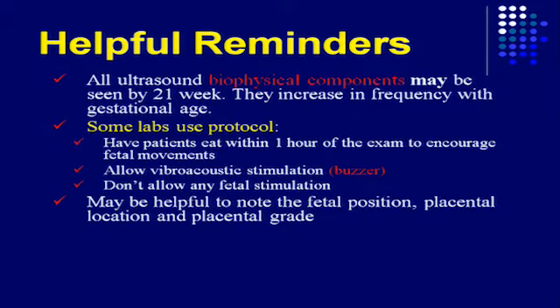But sometimes, we've had a couple that have had in utero strokes. So the things that you get the breathing, they're still doing the breathing, but they're not doing the movement and tone. So make sure that you do look at each component individually. And it was one of our nurses who picked that up because this baby just is not moving the way it used to.